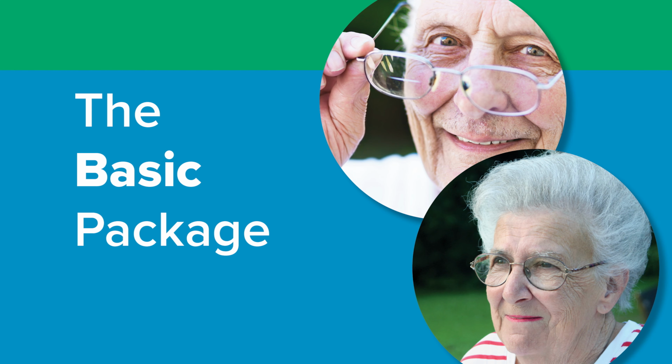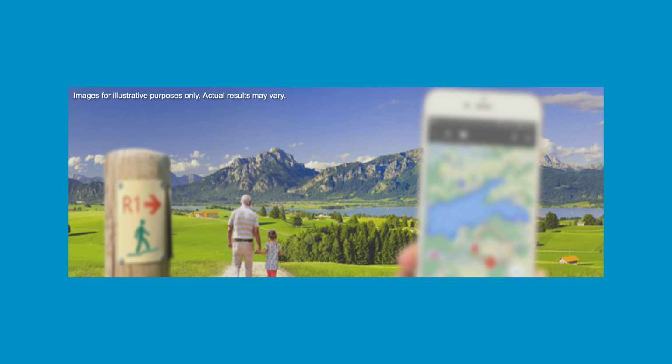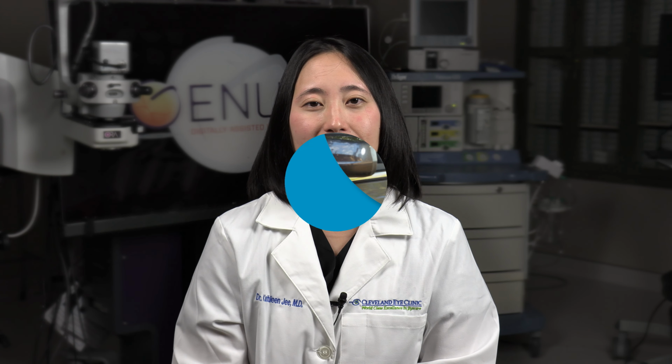If you choose the basic lens, I can help improve your vision with glasses or contacts. This lens doesn't correct for astigmatism, so after basic cataract surgery, you will need glasses for your best vision. This lens only corrects for either distance or near focus. Most patients prefer sharpest distance focus, so you can expect to wear a thin pair of glasses for distance and reading glasses for up-close vision.